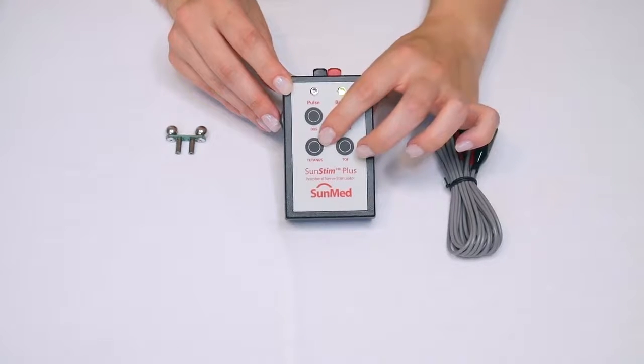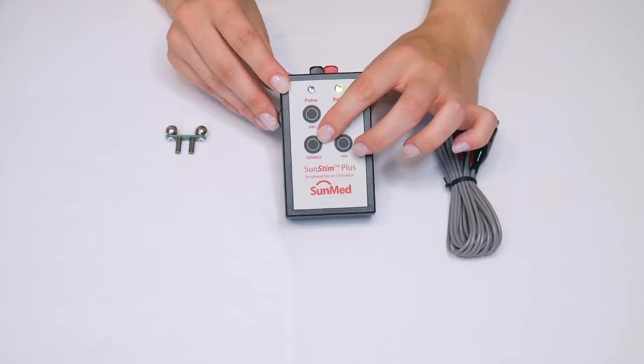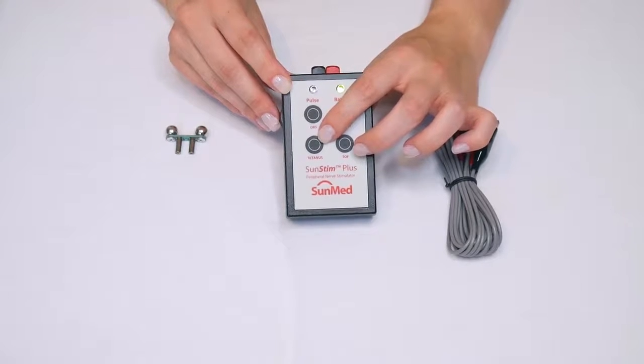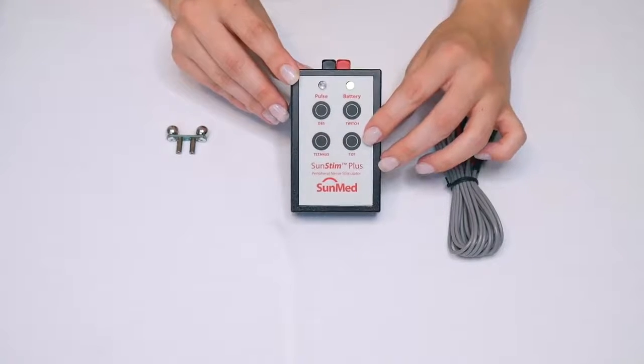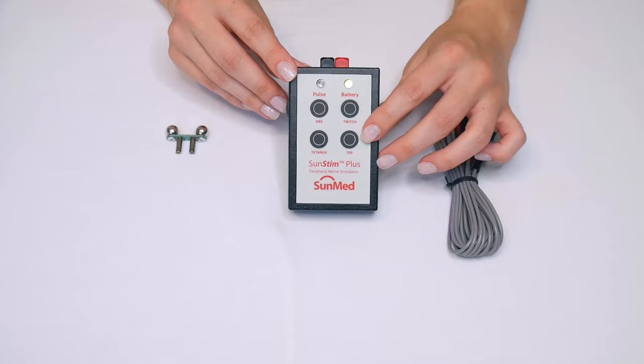Tetanus mode produces a rapidly repeated stimulation when pressed and held down. TOF is your train of four, which generates four equal intensity single pulses in a period of two seconds.